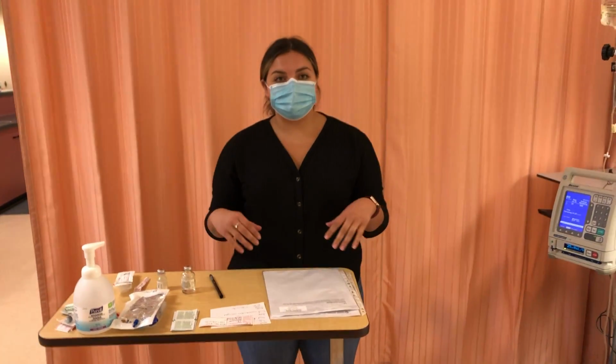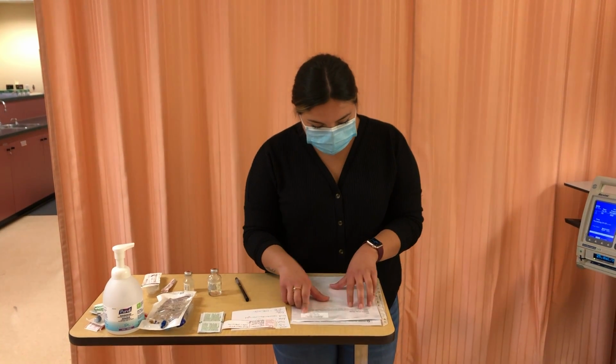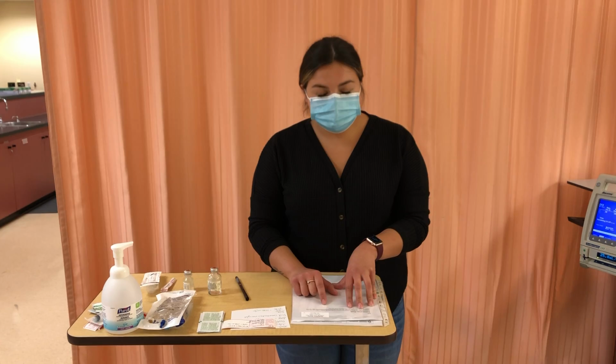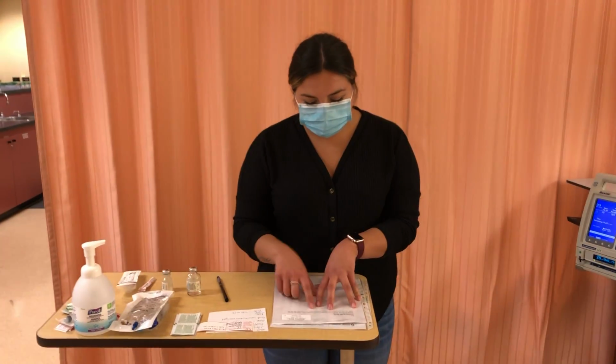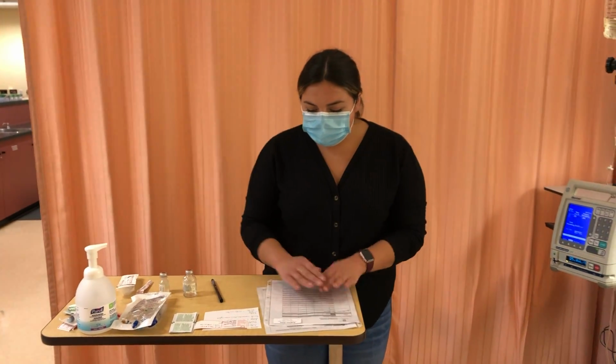So today I'm going to be preparing a medication for a secondary infusion. So I'm just going to review my scenario. I have Emma Wrightson. She is a 30-year-old female. 3 days ago she was scratched by her cat and is now experiencing cellulitis in the left arm, and she's been prescribed antibiotics, so I'm going to be administering those.